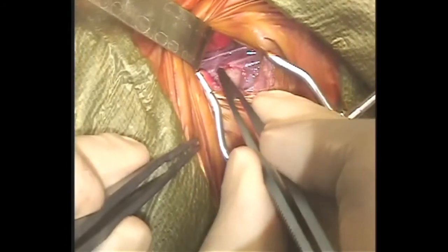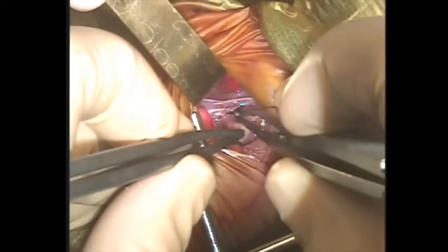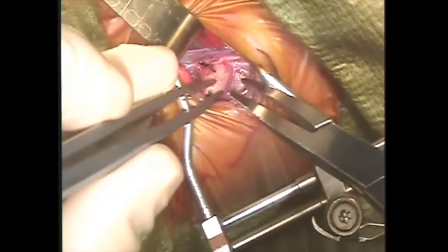Below the vagus nerve, careful blunt dissection is used to circumferentially isolate the PDA. It is important to avoid manipulating the PDA directly as this can be friable tissue. Once the PDA is nearly circumferentially dissected, a test clamp is done and the lower extremity blood pressure is checked. Once there is no drop in blood pressure, an appropriately sized vascular clip is placed around the PDA while ensuring the vagus nerve and left recurrent laryngeal nerve are not involved, and two MRI-compatible vascular clips are applied to the PDA.